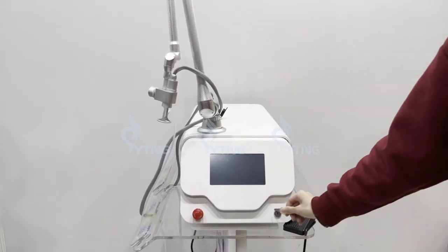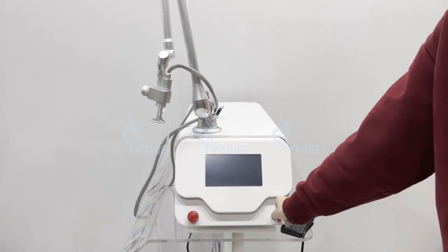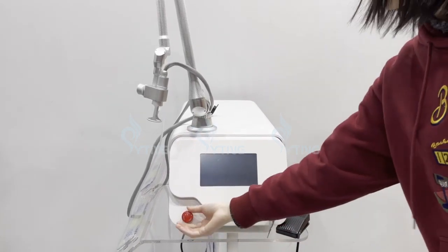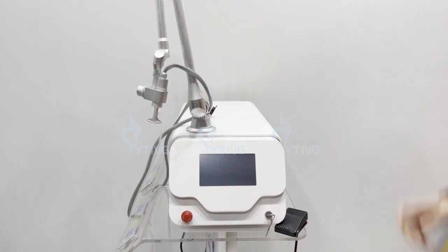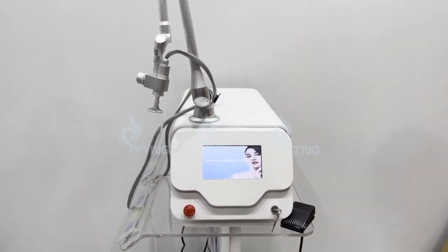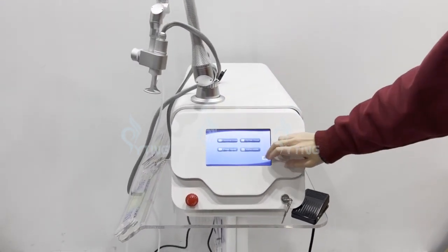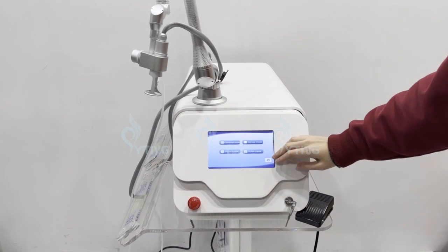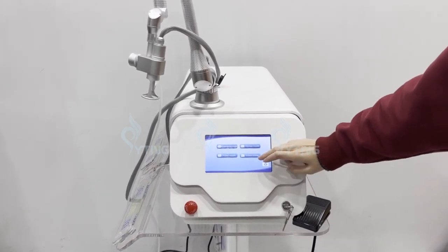Now we insert this key to turn on the machine. Rotate this button. There are four functions. Now we choose this bubble mode.